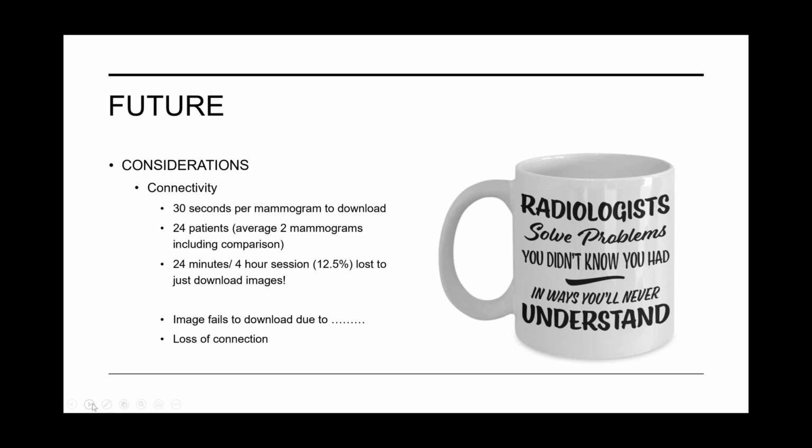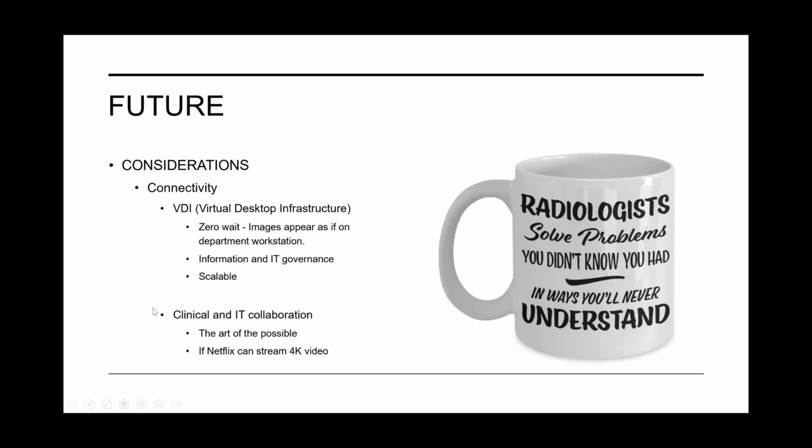And certainly looking forward, we do have that with the advent of VDI, and certainly with the benefit of lossless VDI, you've got a zero wait, because essentially the images appear as if they're actually on a department workstation. You also cover the issues of information and IT governance, thinking about what happened in Ireland with their cyber attack.